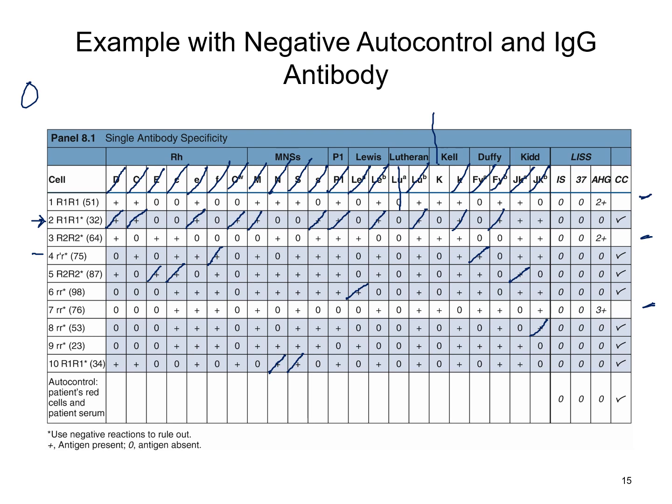So let's look at the other things. Do we think we're dealing with an IgM type of antibody? Did we have reactions at immediate spin? No. Do I think I'm dealing with one of these 37-degree or AHG type of reactivity of an antibody? Yes, we do know that Kell is an AHG. That matches that.